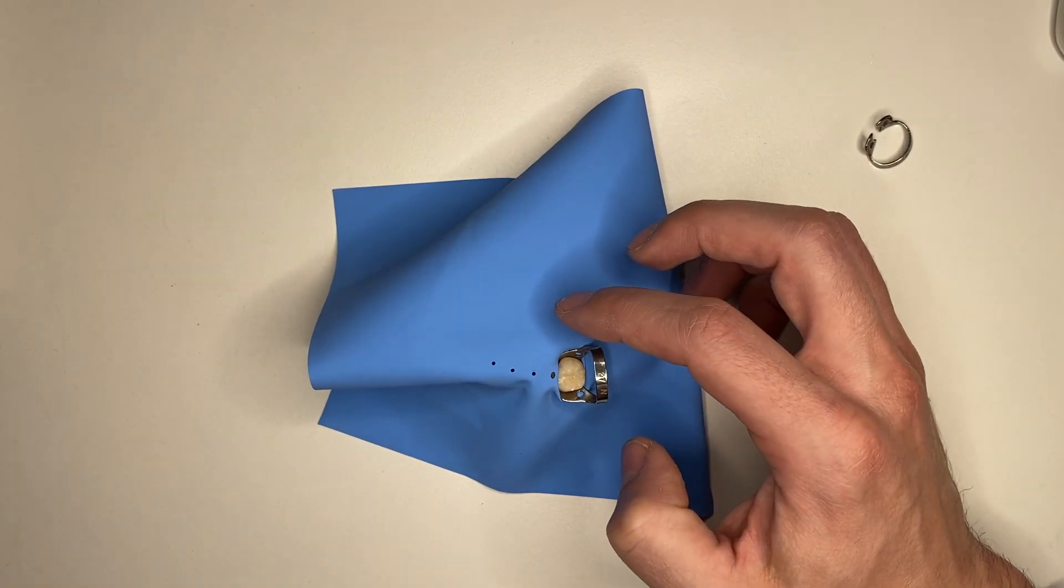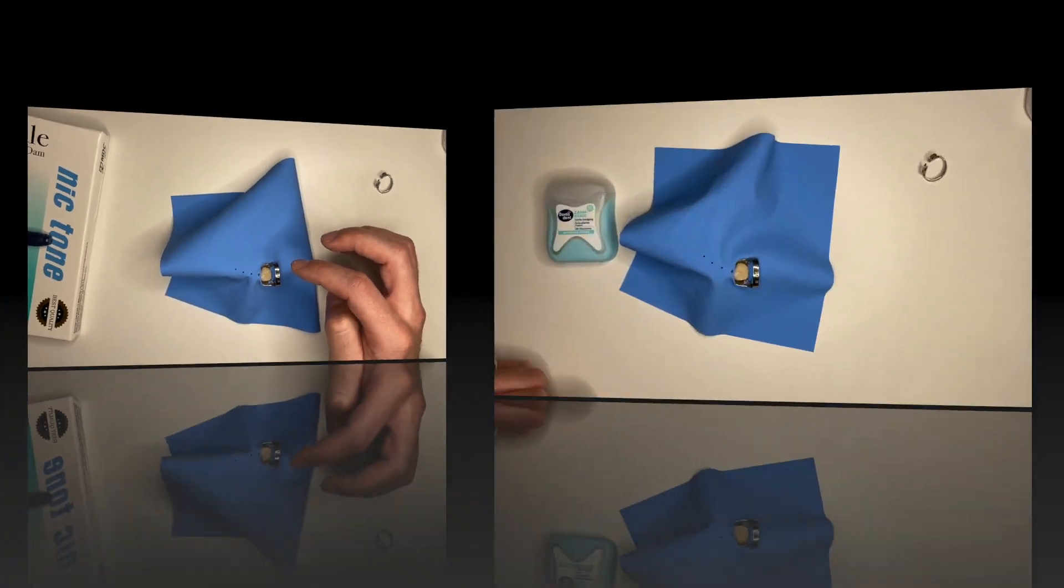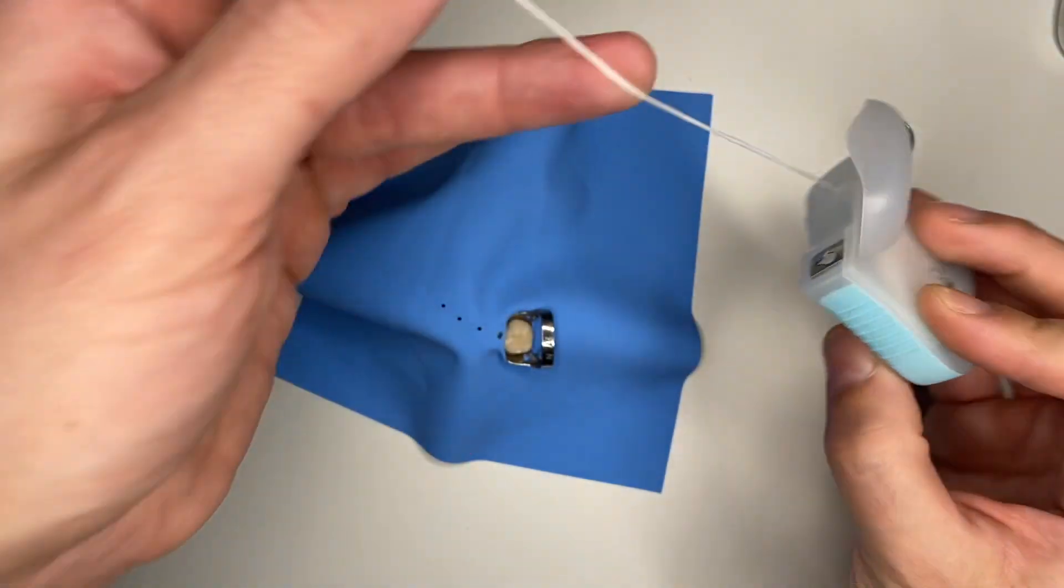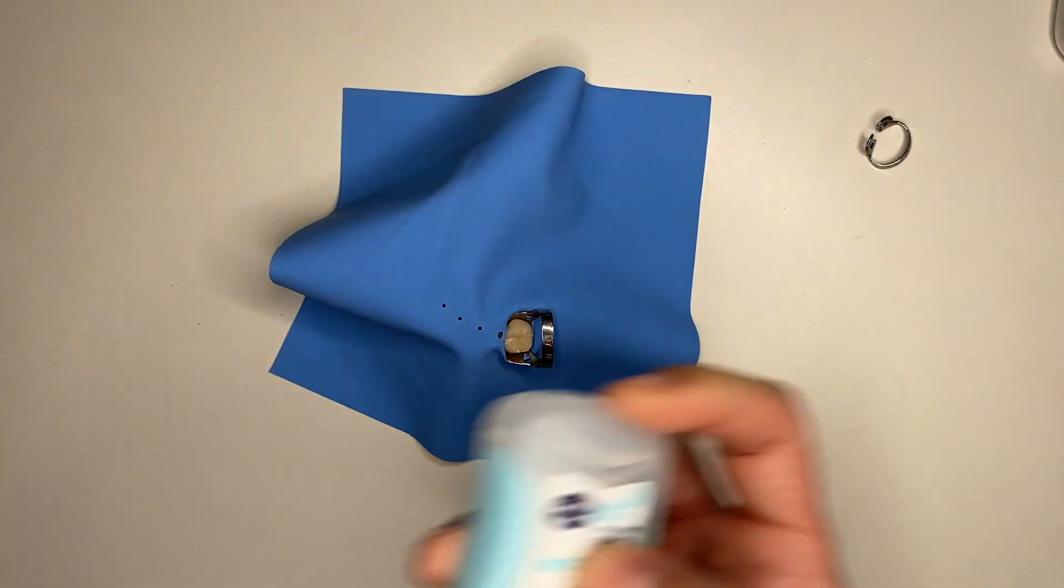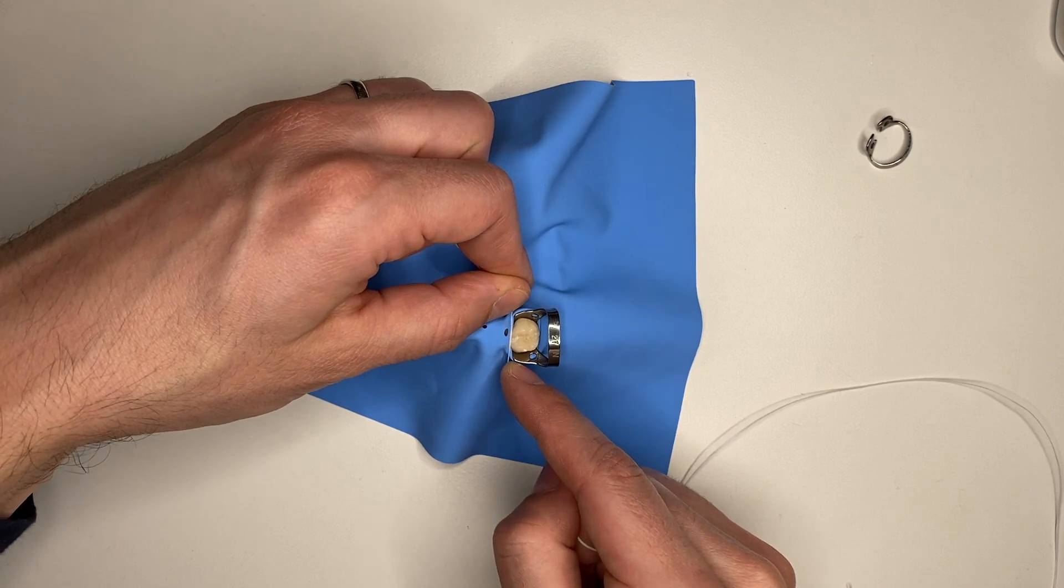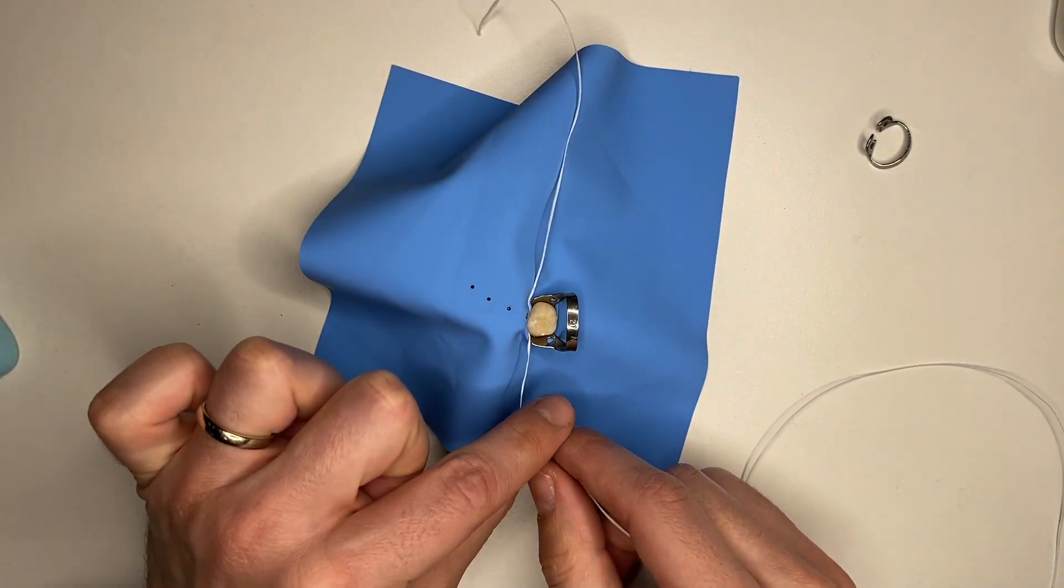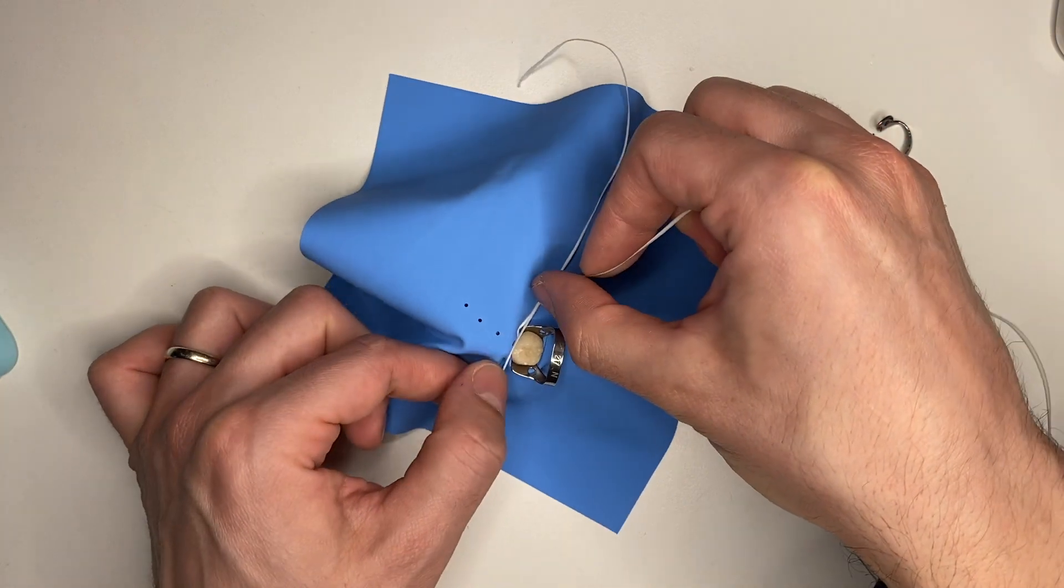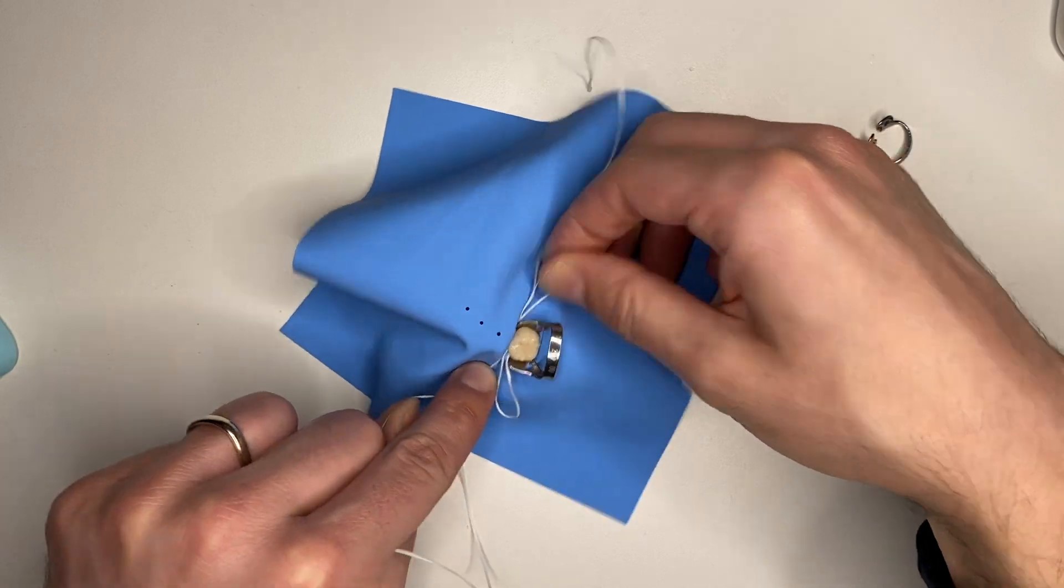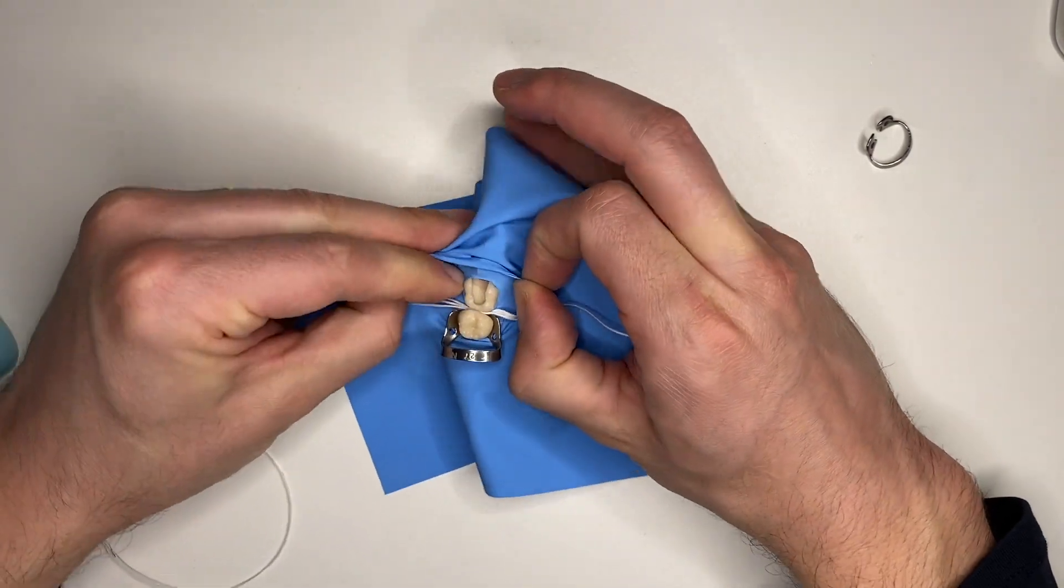I like using this floss because it's quite thick. You can find it in any pharmacy. Get a nice long fragment, and then I'm not going to try to force too much rubber dam in at a time. I'm going to go in gently, then I'm going to make a loop, go through again, make another loop, go through again. Now I can take my rubber dam over the remaining tooth structure like this.